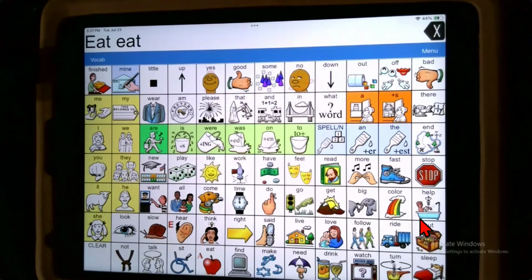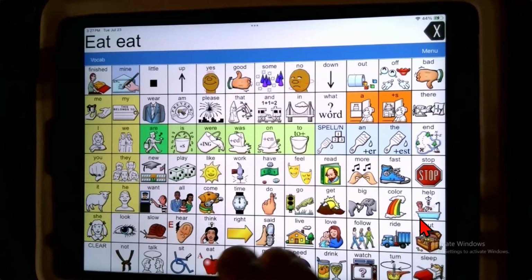And he nods his head, let me say eat, let me say eat. And you try to give him a show, and it's down in here, and you're doing the least amount of prompting possible, and it's not working. He just can't find it. He's slapping at it, get excited.